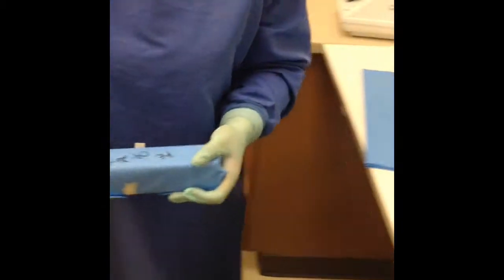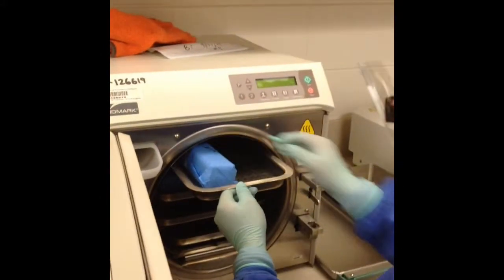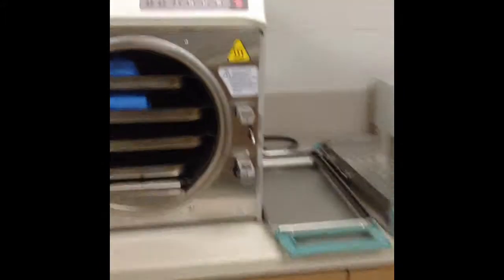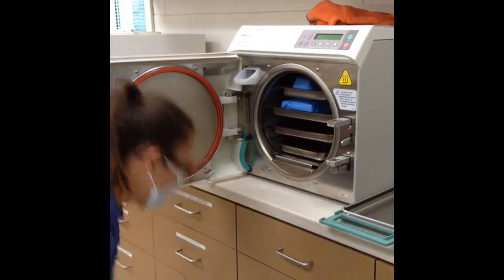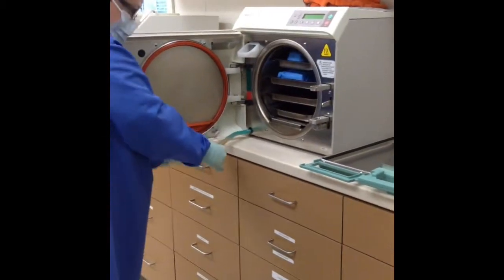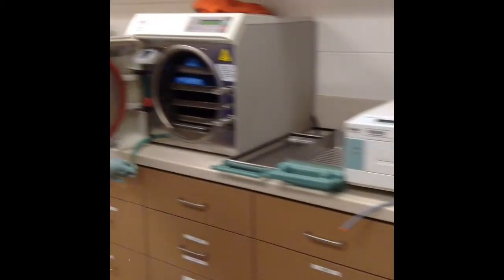We are now ready for sterilization. For this one we are going to use the ultra-plate. She is going to load the instrument cassettes in the autoclave loosely. If you are using a paper pouch, the paper side always needs to be faced up. She is going to add distilled water if needed. The distilled water is located at the end of the counter next to the washer and dryer. The water level needs to be in the green.